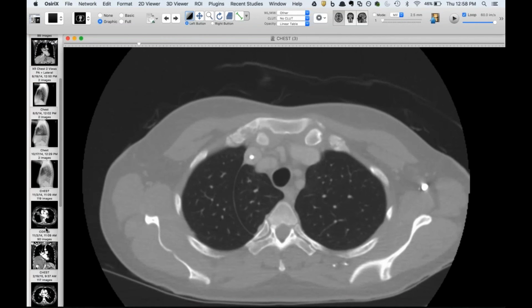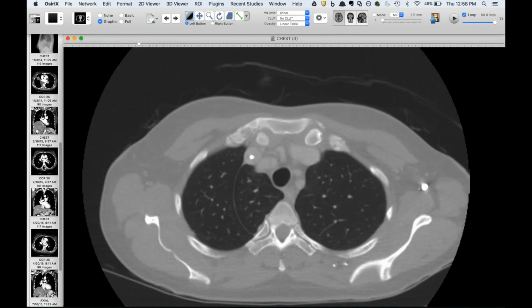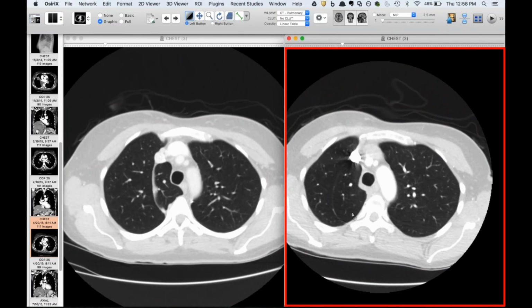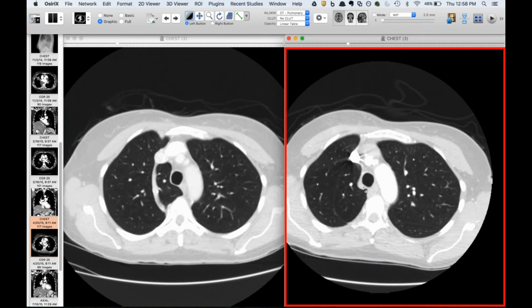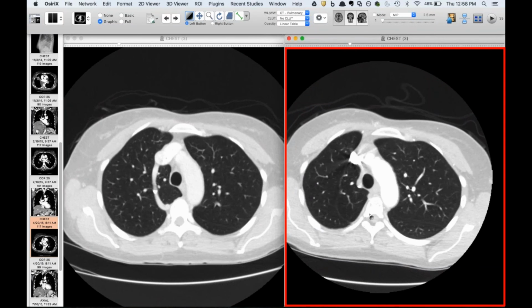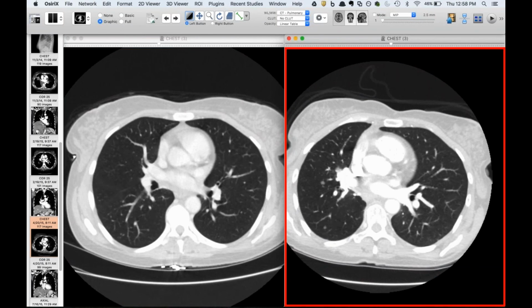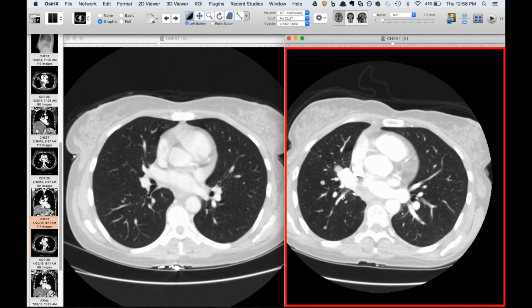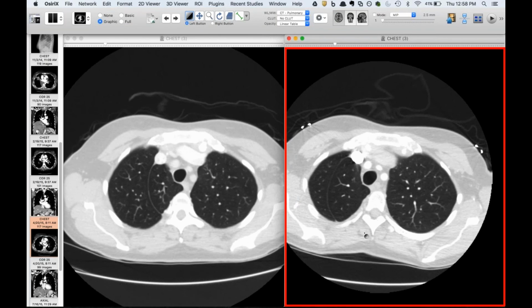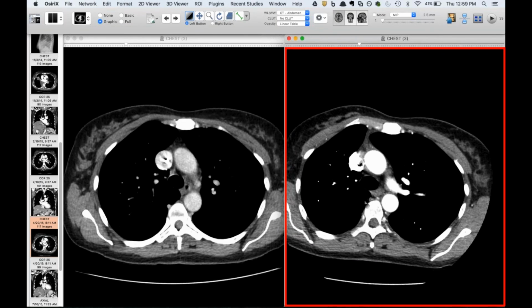And then this patient underwent, I think, a bilobectomy. But let's see, I'll just pull up one of their post-op studies. And you can see now there's the fissure, and there's the azygous vein back along the mediastinum. And you can see they got more metastatic disease by this point. But yeah, so it popped out when they did the right middle and lower lobectomy. Keep scrolling, Travis, because yours hugs the mediastinum quite nicely immediately. Oh yeah, it does. It kind of popped completely back into the mediastinum where it should be.